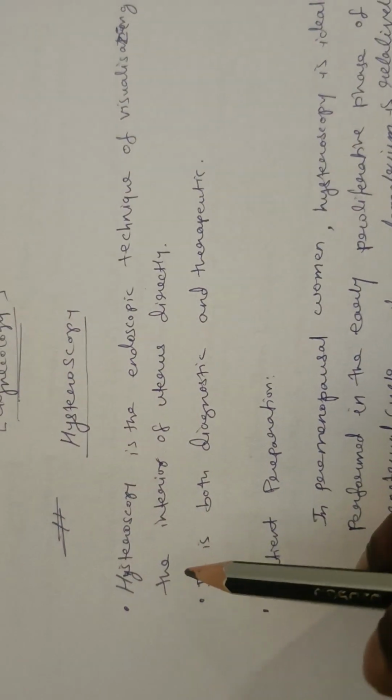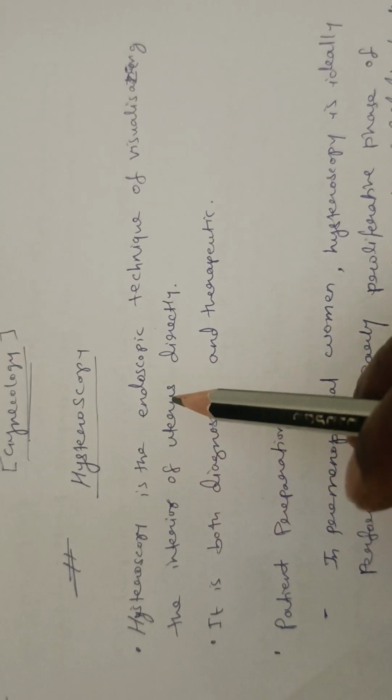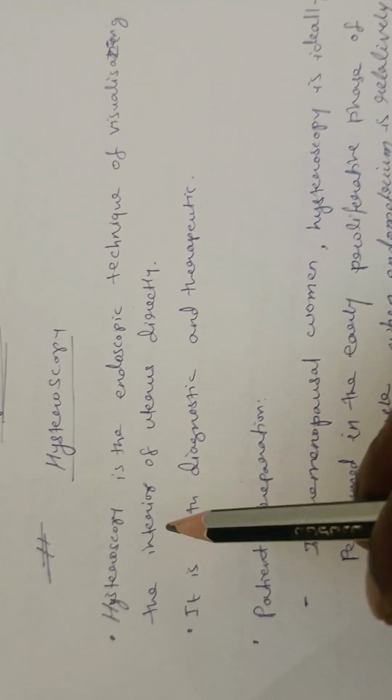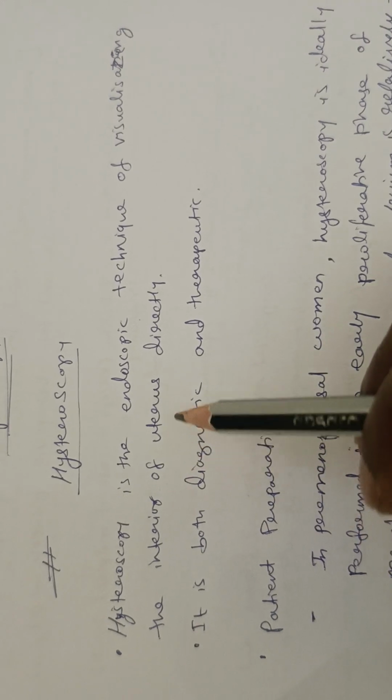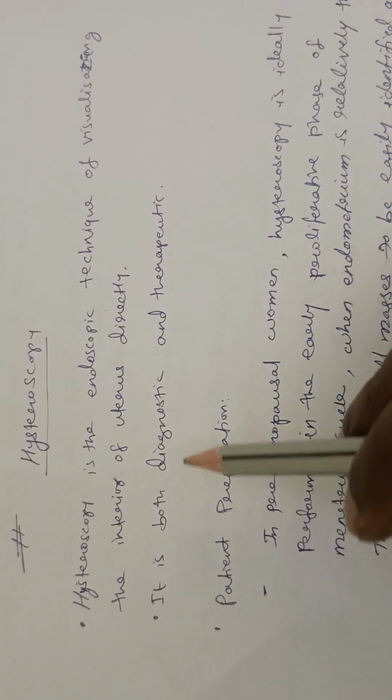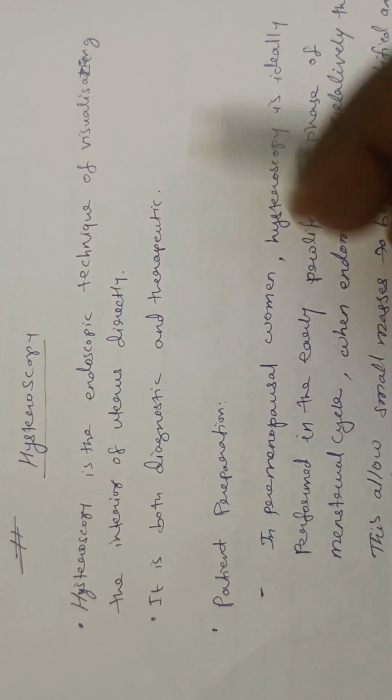Hysteroscopy. Hysteroscopy is the endoscopy technique of visualizing the interior of uterus directly. It is both diagnostic and therapeutic.